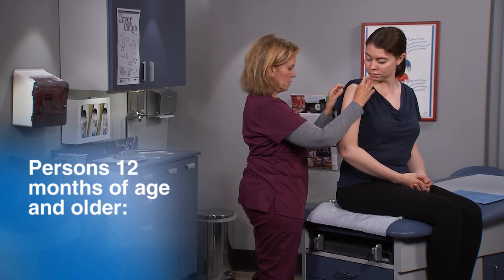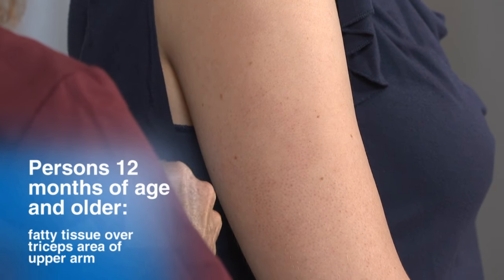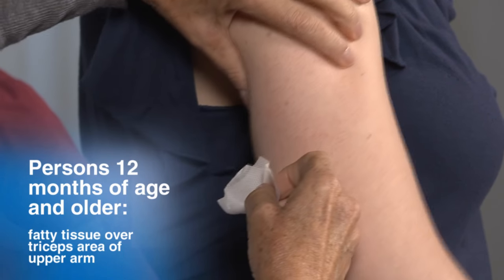If needed, the fatty tissue over the triceps area of the upper arm can also be used. For persons 12 months of age and older, the recommended site is the fatty tissue over the triceps area of the upper arm.